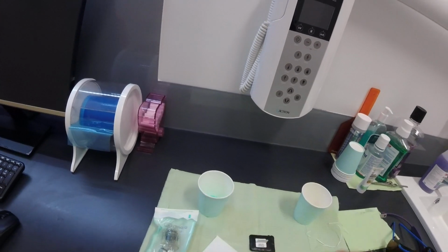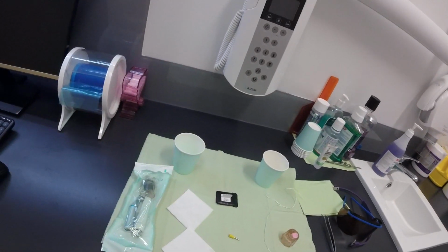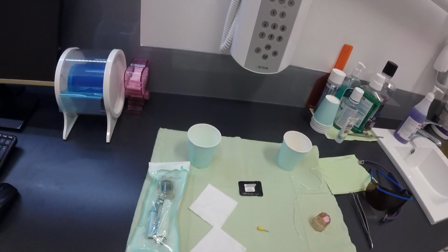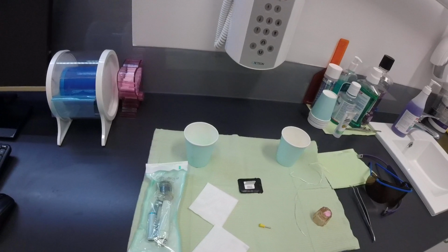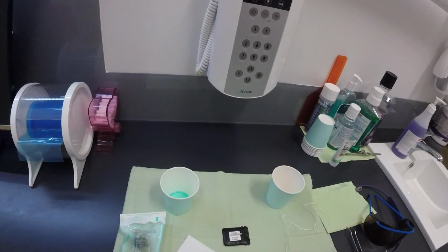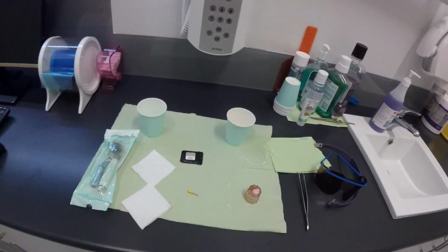So it's a 30-second swish, then into the bowl, nothing to eat, drink or rinse for half an hour afterwards, just so it can absorb into the tissues and the teeth. It just helps harden the teeth. It's really healthy for the gums and teeth. So yeah, let's go through it again.